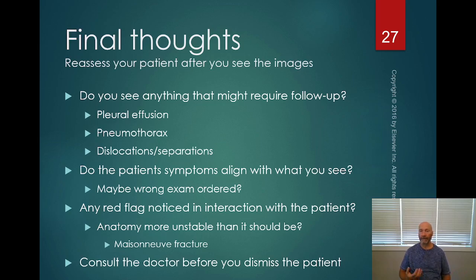It very well may be that what they're doing, especially in pediatric patients, is doing a comparison view between the two to see if the epiphyseal plates are intact or if there's some sort of potential fracture through those. So there's a legitimate reason sometimes to do the opposite extremity, but it's worth investigating. If you have no context as to why you're shooting the opposite, then ask.